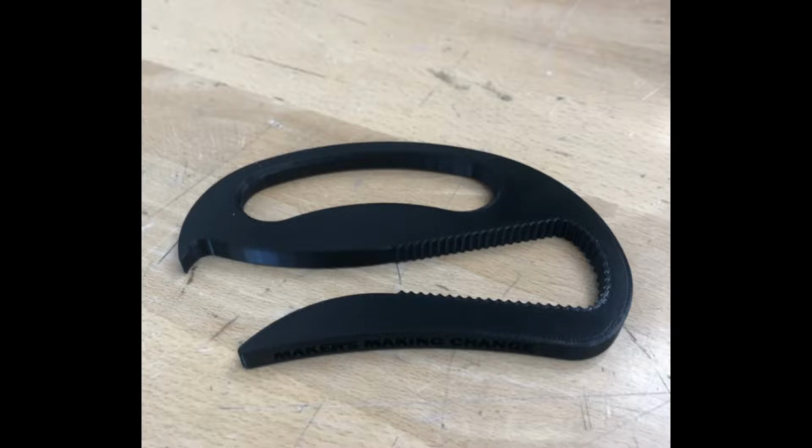This video is part of a series of videos that I'm making. They're designed to teach occupational therapy practitioners, educators, and students about applications for 3D printing in their practice. My goal is to provide videos, resources, and instructional templates that'll help walk you through the process of using a 3D printer. Now in this video, we're going to take a quick look at some of the existing assistive technology that is available for free online and walk you through printing it out.